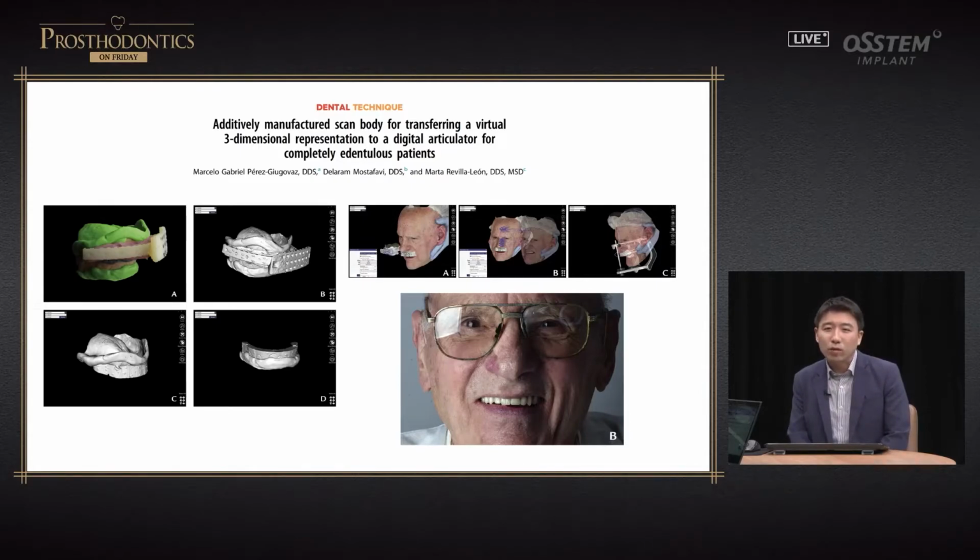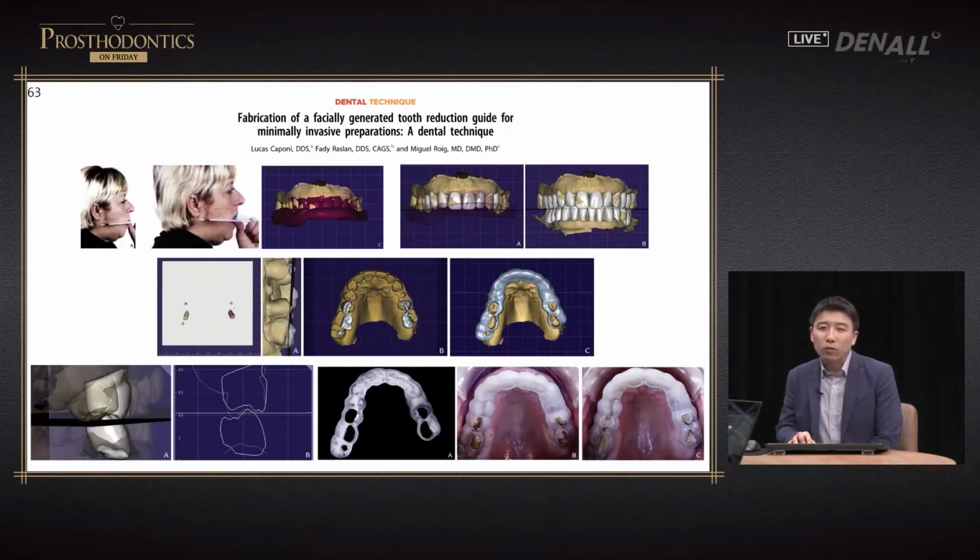You take an impression of upper and lower, and you add the jig for facial scan data and do facial scan. Aesthetic evaluation is done. Midline is set. Different attempts are reported. I've talked about occlusal planes, but there are many difficult cases such as full mouth case.